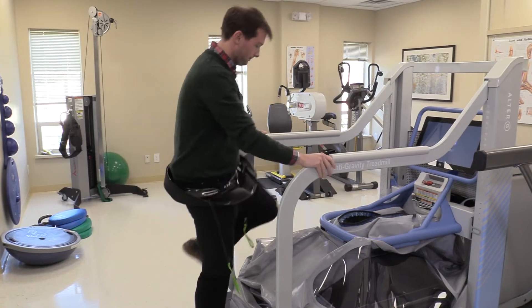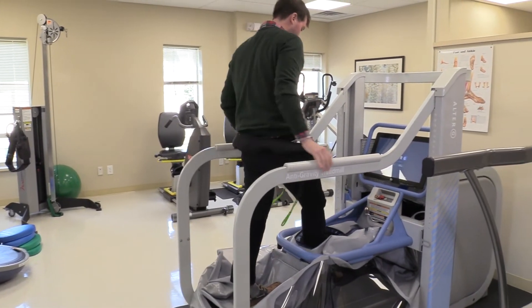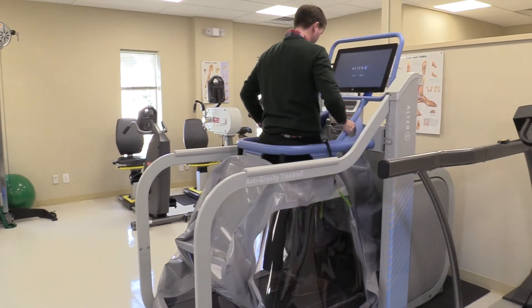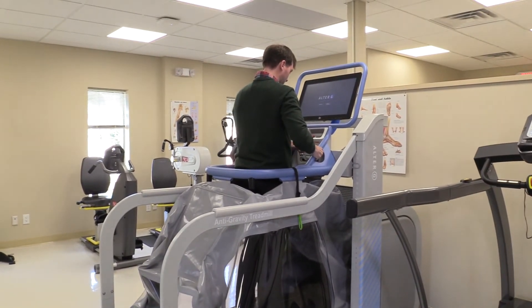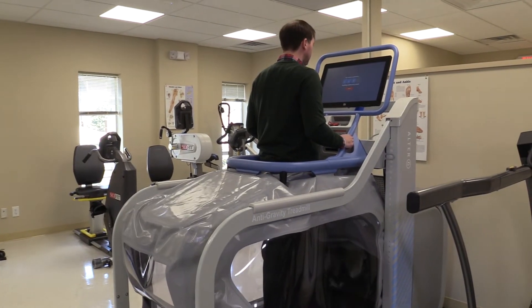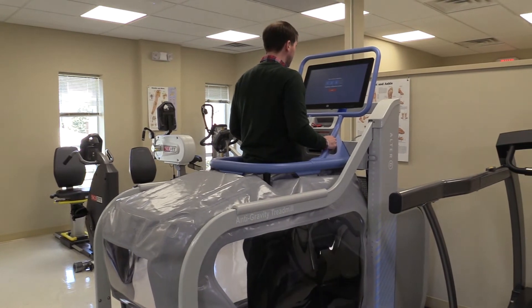From the time the patient comes in to the time they get in the machine, it usually takes about 90 seconds. You just wear a tight-fitting running short or leggings, or you can put the shorts over your clothes. You pull it up, there's a zipper around it, you zip yourself in, and the machine will calibrate your weight and get you started within a minute or two.